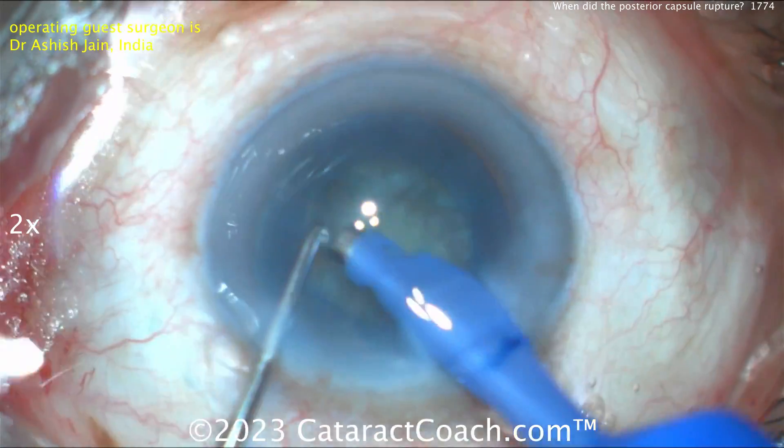Cleaning it up here. The question is — and I want your help — when did the posterior capsule rupture? It's not so easy to tell. Here's the end of the case: lens going in. The 7L rule — leading haptic looks like the number 7, get that in the eye. Just put it on top of the iris for now; you can get it dialed in later. Then there's the trailing haptic — letter L. 7L rule in effect, that looks good. Be cautious putting this in — don't let the lens go into the vitreous cavity. Nicely dial it into position.